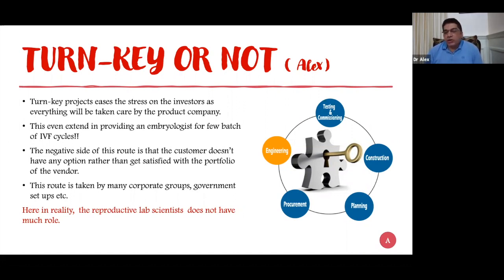But the negative side of this route is that the customer usually doesn't have much say on the type of equipment they want in the system. That is one of the things that we see sometimes. And occasionally we see that the lab scientist or the embryologist doesn't have much say on these things, maybe in the initial time. Especially we have seen this in the batch IVF centers in India. So there is a positive side and a negative side to it, but that has to be balanced by the investor or the person who is starting the program.